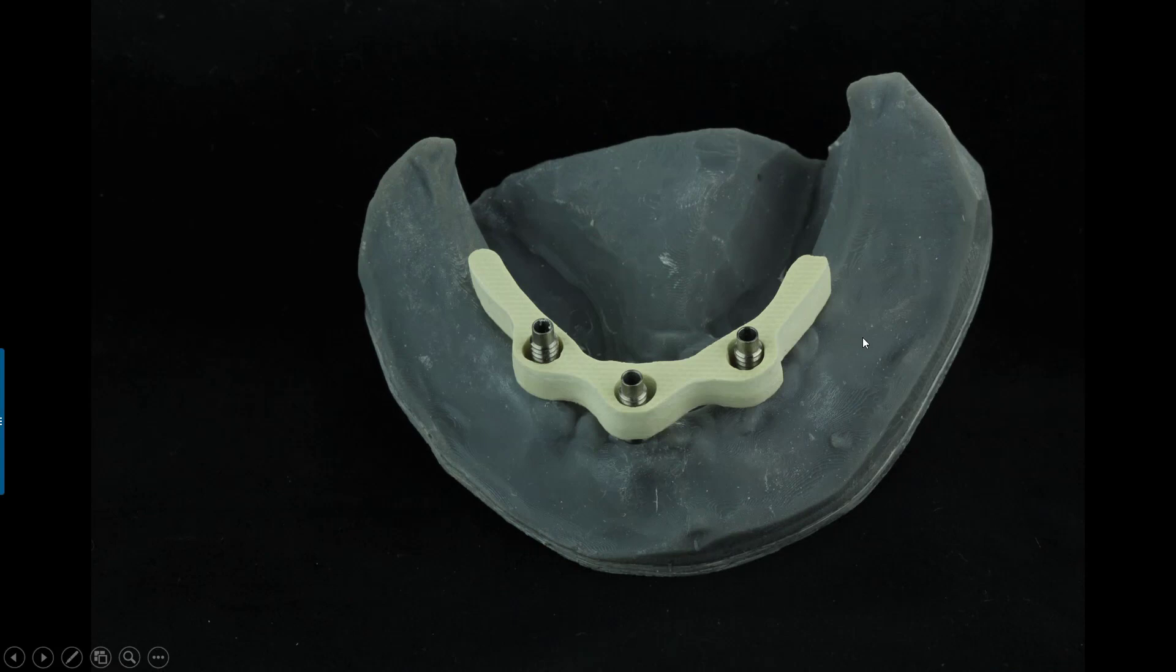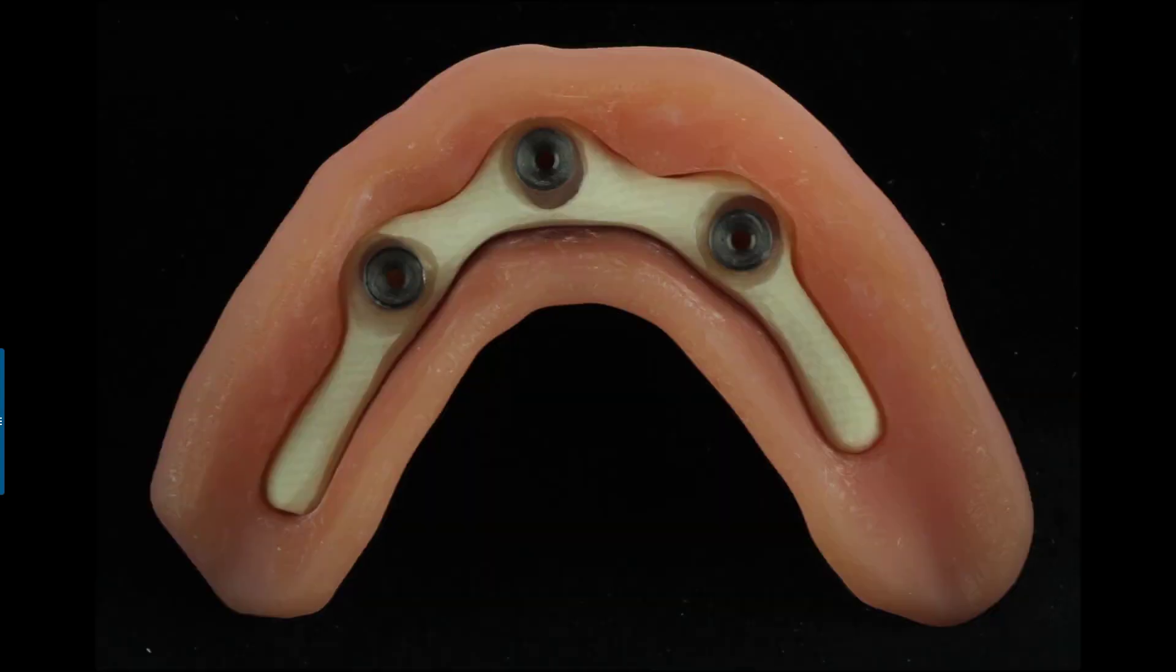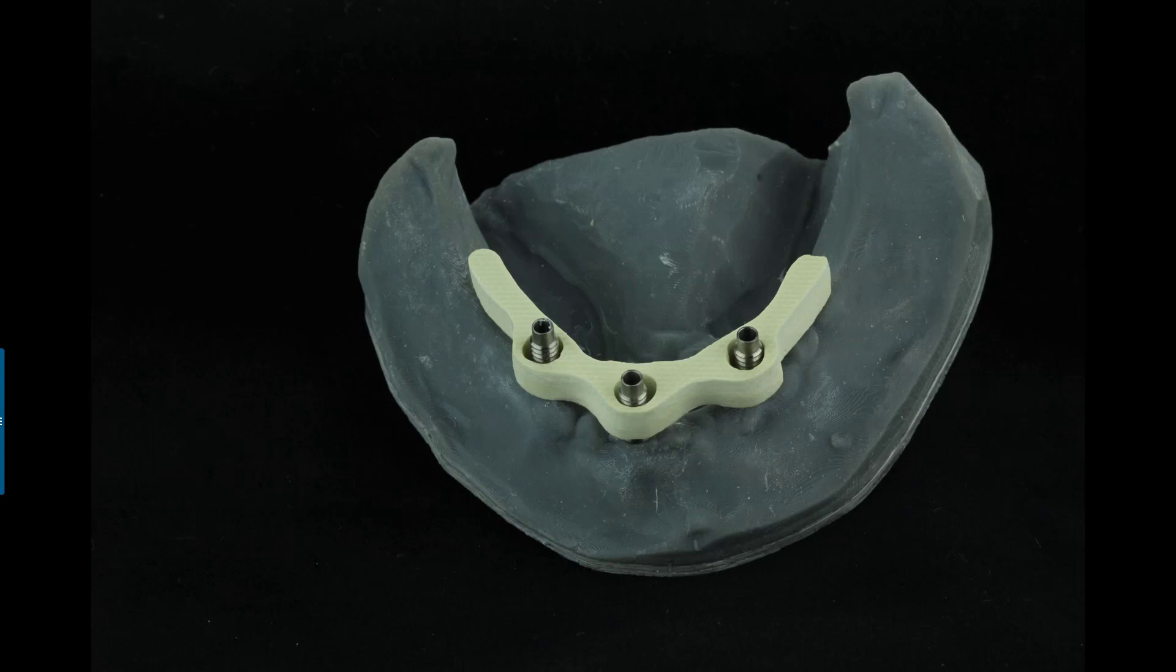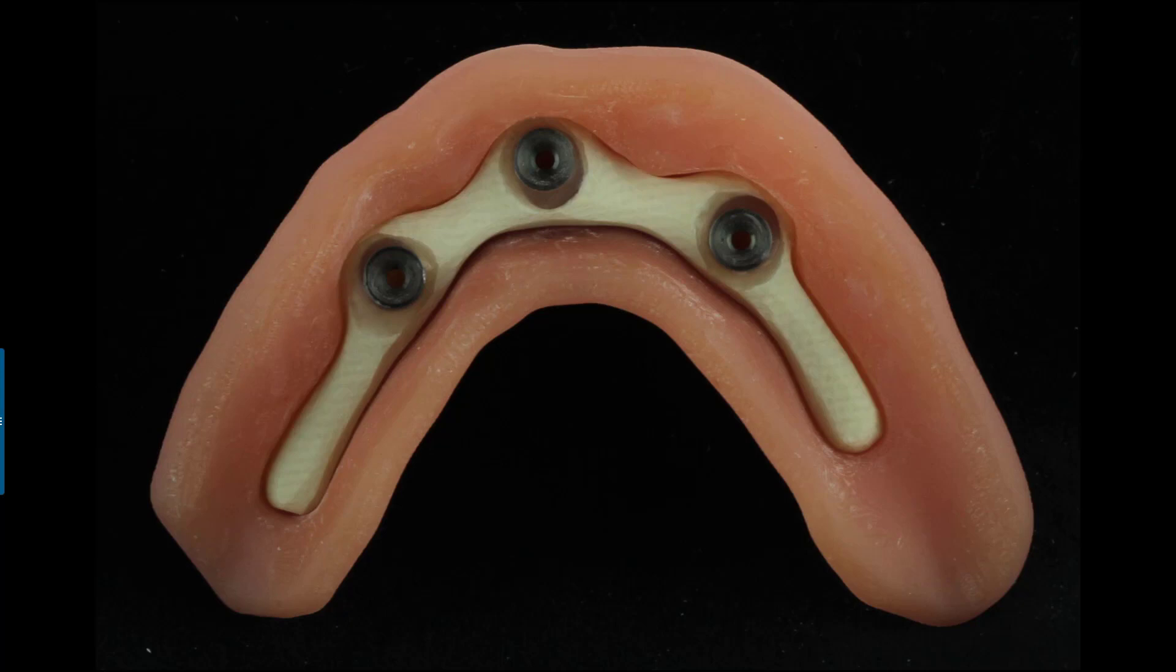And even in these small dimensions, this is incredibly strong. I've actually taken this very restoration to many, many classes and had about 500 people try to break this, and no one was able to. So from there, if the patient had an existing denture, you could hollow it out and do a pickup of this material on the inside, then all you have to do is salt and pepper the underside and make it cleansable and ovate.